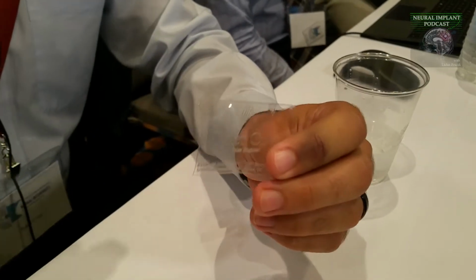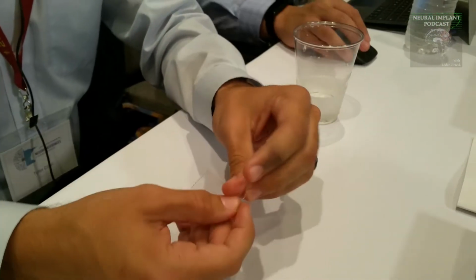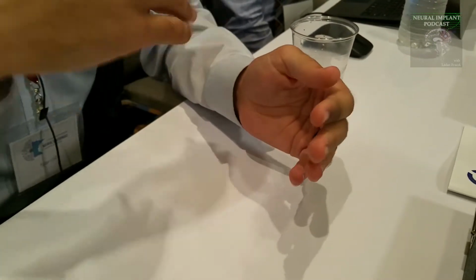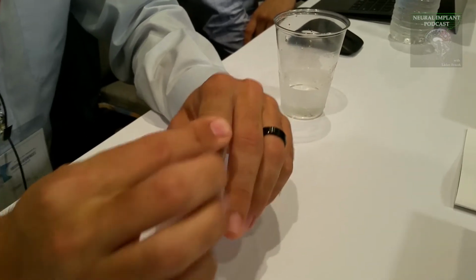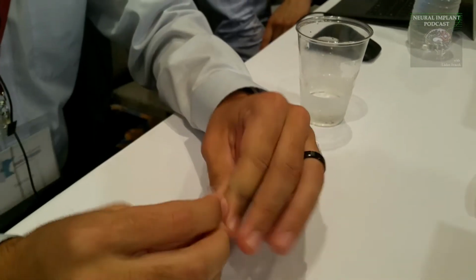So this makes for an easier implantation process, as the devices can go in at a stiff modulus. It's easier to puncture the brain if it's a cortical probe. It's easier to mold it around the electrode if it's medium stiff like this. So for a peripheral cuff, we suggest slightly softening it before implantation. And then once it's inserted into the body, it softens and really lessens the foreign body response by mimicking the body's stiffness much more. If there's any jarring through the animal moving, then it's much less likely to cut up the brain or damage surrounding tissue. And then as a peripheral cuff, it really gets a nice connection between the electrode and the nerve that it's wrapped around, because it softens into the same molding as the nerve itself.